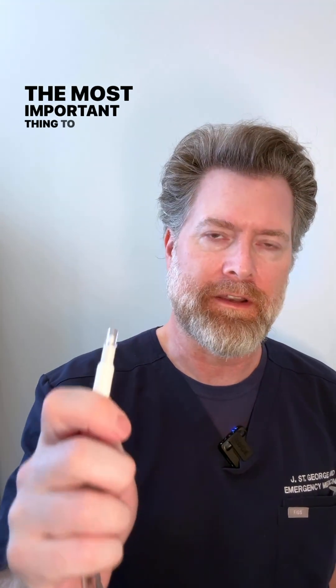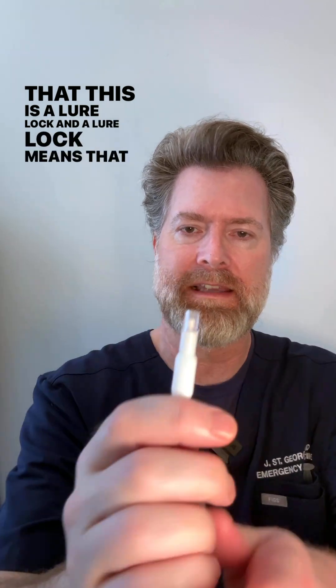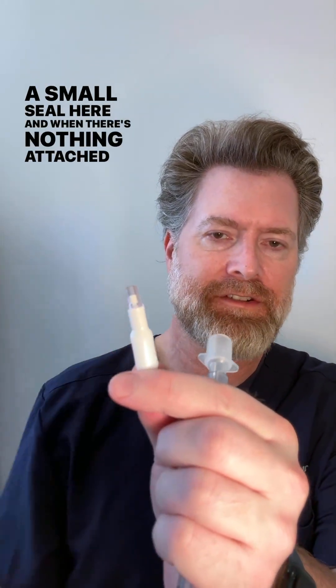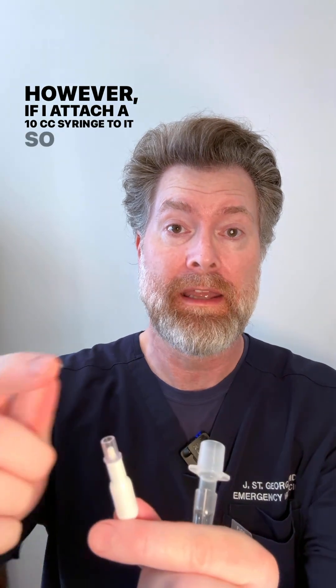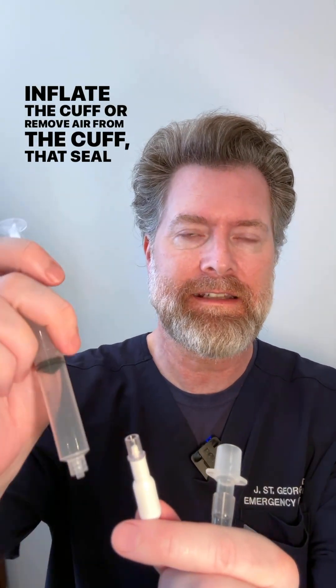The most important thing to know about this device is that this is a luer lock. A luer lock means there is a small seal here, and when there's nothing attached to the luer lock, that seal is automatically closed. However, if I attach a 10 cc syringe to it so that I can inflate or remove air from the cuff, that seal is open.